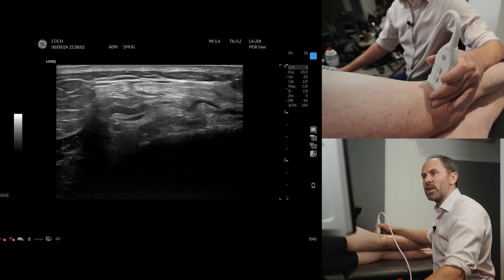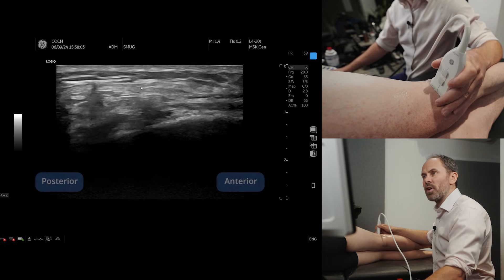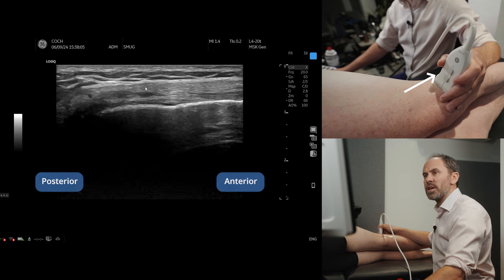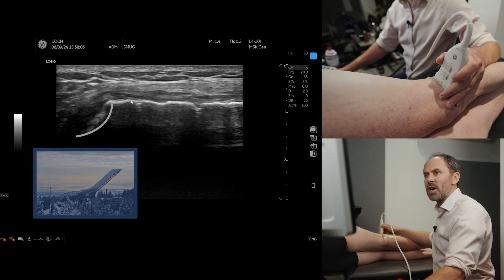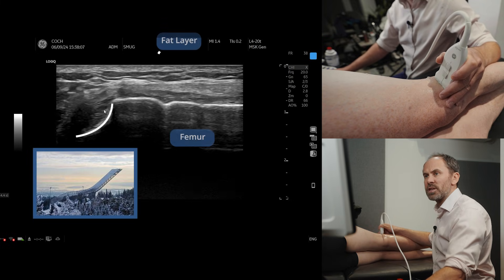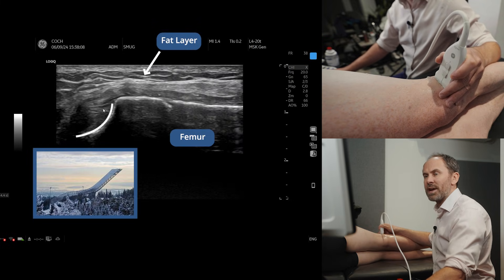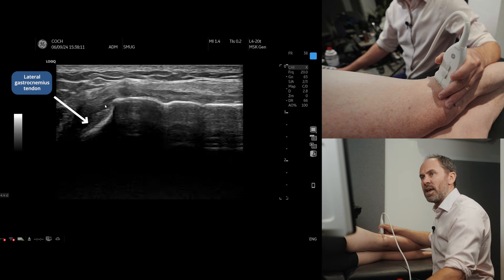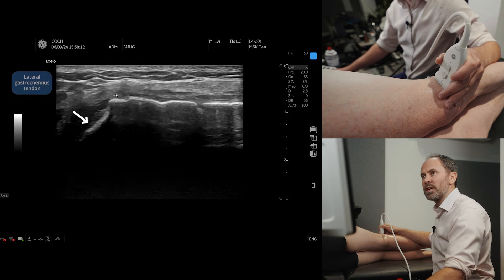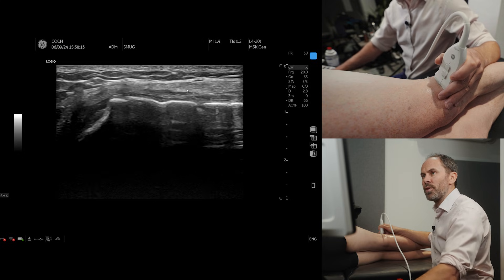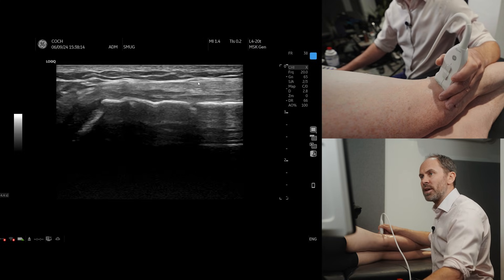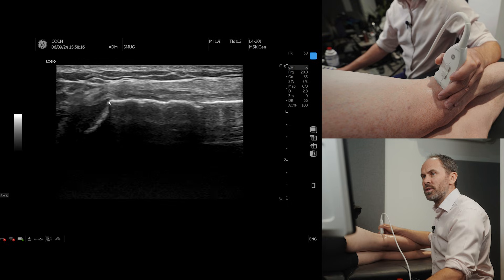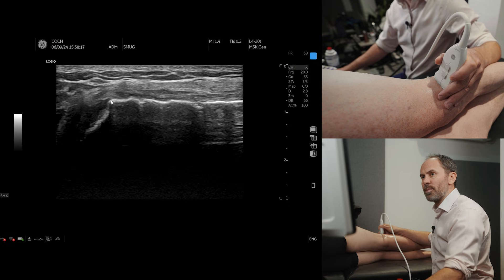If we slide down until you see a ski jump — there's your ski jump where your lateral gastroc tendon attaches in — you can see that at the moment the ITB is anterior to the ski jump.